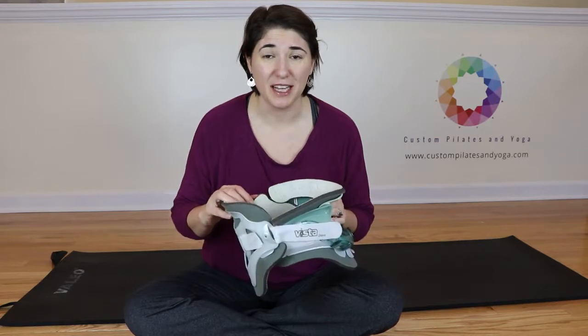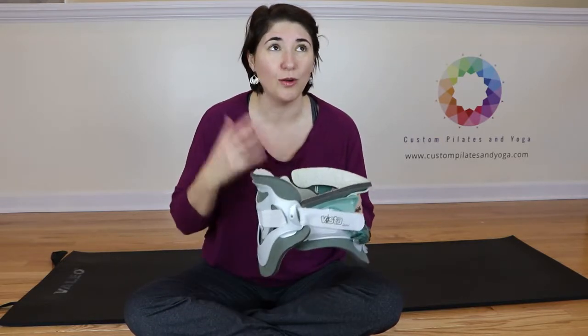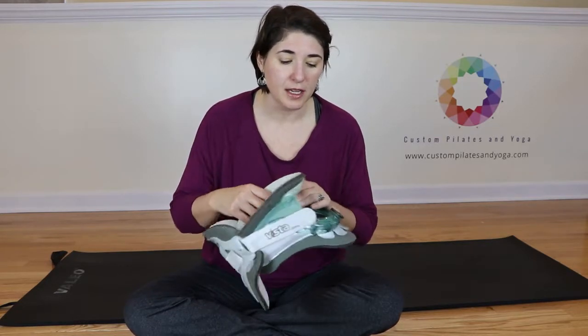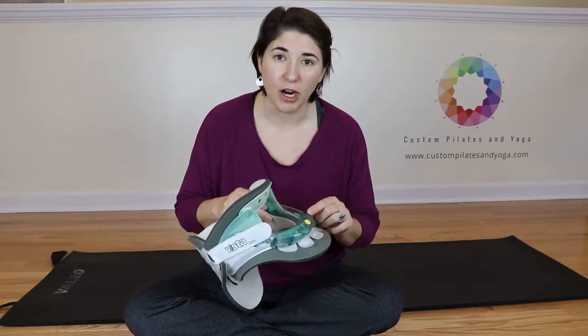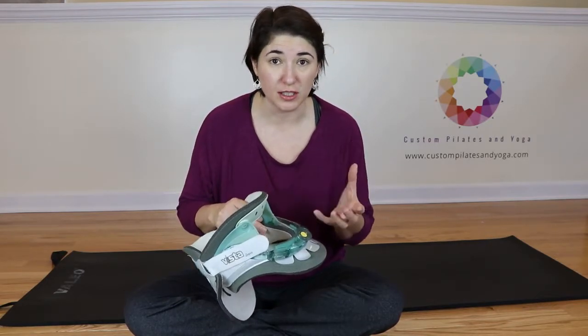These replacement pads that I got for this — it's silly — they're almost the whole price of a whole new neck brace. But the important thing is this plastic structure of the neck brace is what your doctor has adjusted for you.